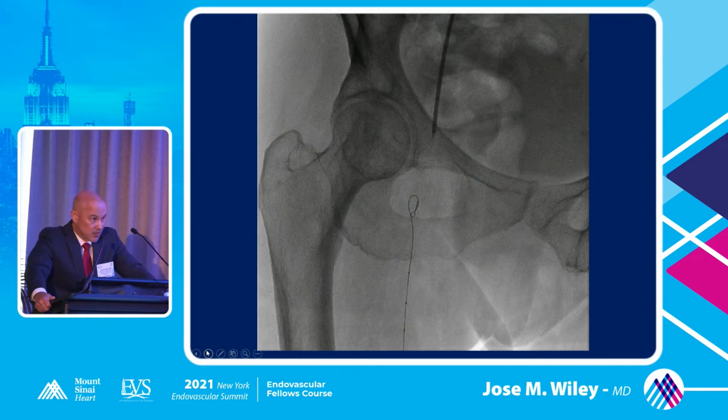which you will learn in the cadaver sessions: when you do ultrasound, you look at the artery and you're going to have two veins side by side. So we accessed, and we did this case sheathless. Some operators would use a slender sheath, as Dr. Kwan mentioned. I particularly prefer sheathless if I can. We advanced a 0.018 wire, I think it was a V18 wire.